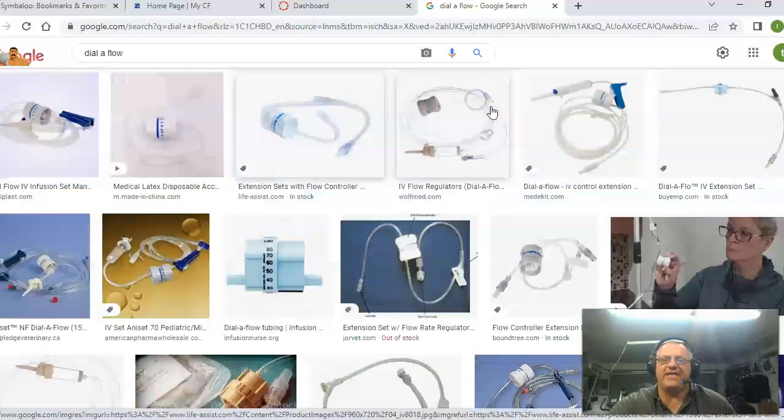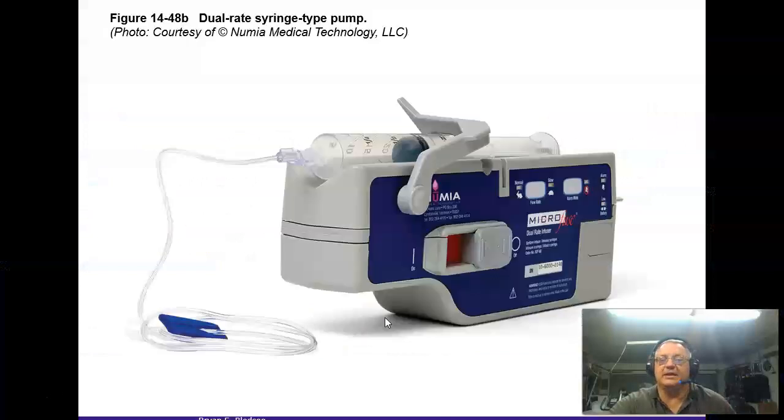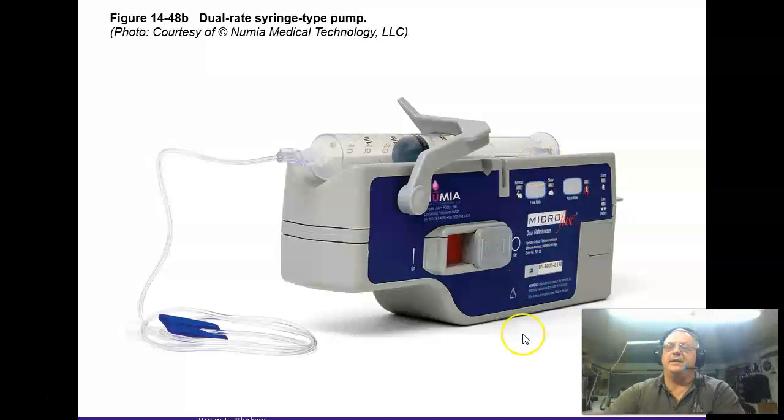If I have that, what I really would like to use is one of these guys right here. Now this is a syringe pump, and I kind of find it funny because this is supposed to go behind the plunger back here. But there's all kinds of different pumps, and whatever agency you use, make sure that you get trained on this. But I will tell you guys, like this syringe pump, I love this sucker. It allows for precise control of medications to be administered to the patient. Now again, we can use the regular hospital pumps, by the way.